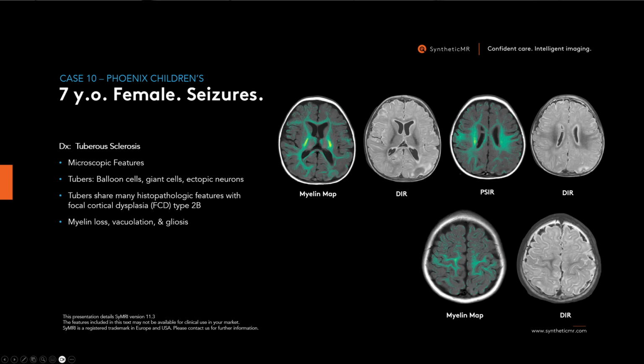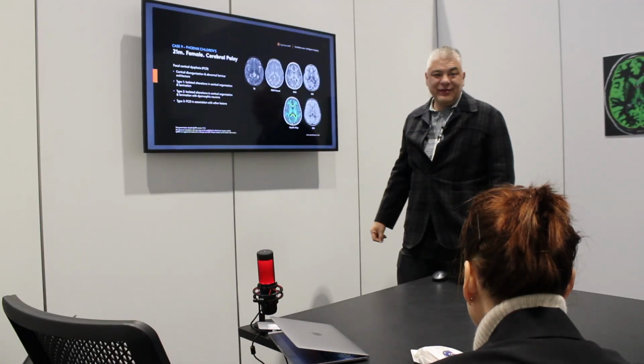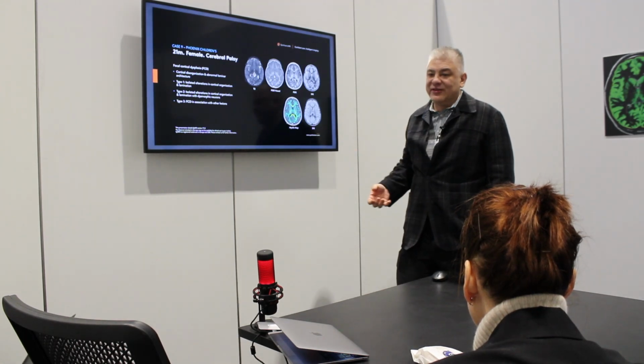Could we see it without the synthetic images? Maybe, but can you really see it here? I don't know. Can I see it here? Absolutely. So it makes a difference. It makes a difference in your practice.